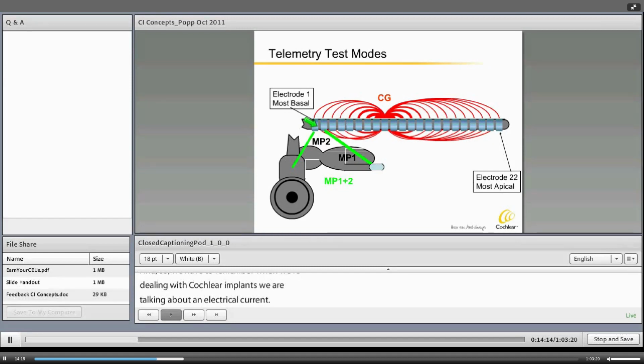And just like when you are jumping the battery of your car, you always have to ground that black clip to something outside of where the battery is, so that as you're sending the current, you're not overproducing the electricity that's going into the battery and blowing up the battery. So to have a complete circuit, we have an active electrode and a ground electrode.